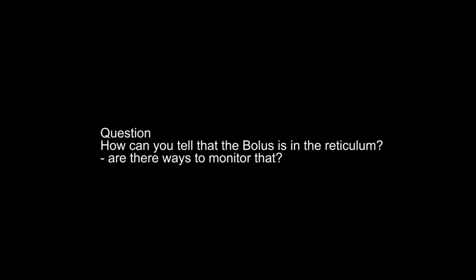Okay, another question that's come through, Toby, is how do you know that the bolus is indeed in the reticulum? How can you monitor that it hasn't floated or moved? Well, that was always our worry in the past, are we putting it in the right place? What we did in the past was take a cow out into a field on a halter and pad around with a metal detector, and you can definitely tell that it's in the reticulum. But there's actually an even more practical way.